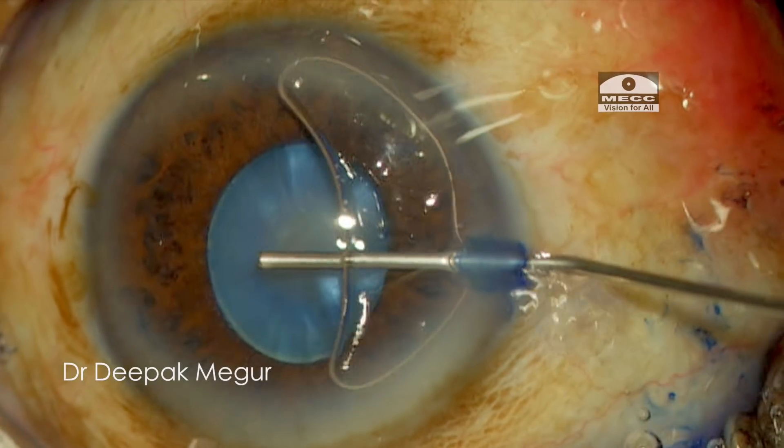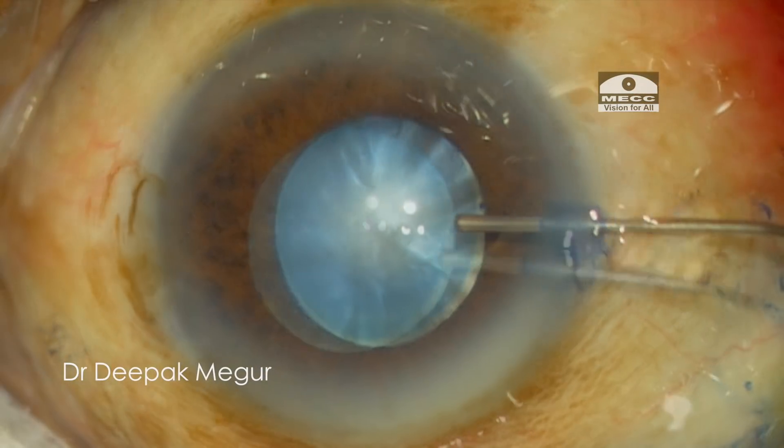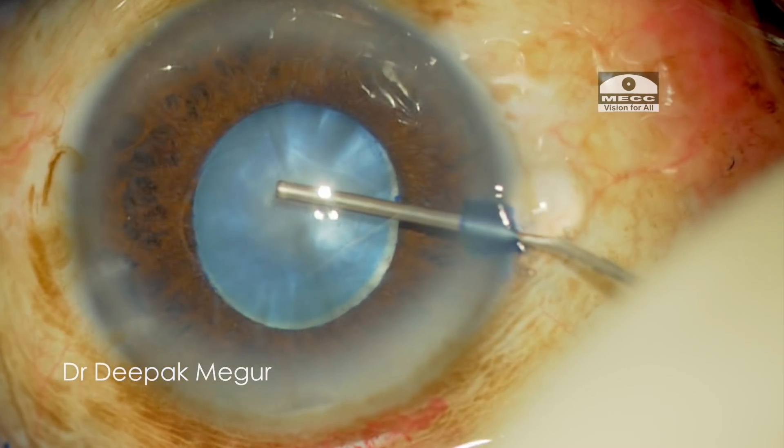I begin my surgery by staining the anterior capsule with trypan blue. Then I'm using the soft shell technique.